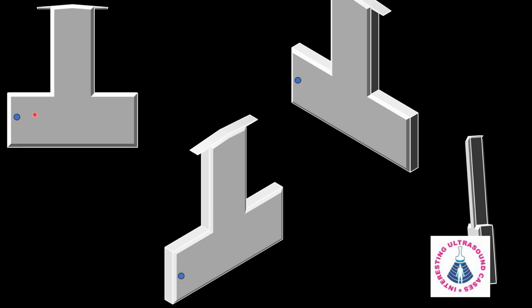Then from the 4-chamber view we are rotating the probe 90 degree to get the sagittal section of the fetus. We will get all the 3 views of aortic arch, ductal arch and bicaval view. The above said positions of the probe are for the fetus in cephalic presentation with dorso-posterior position.